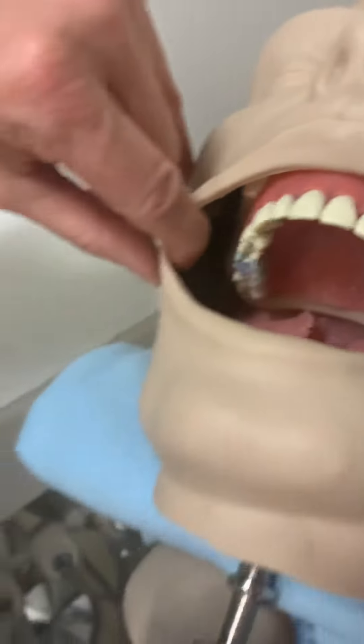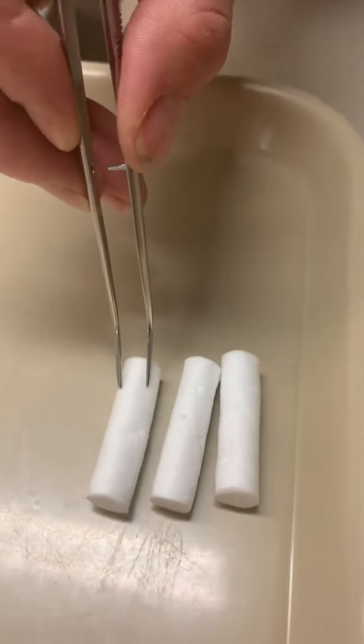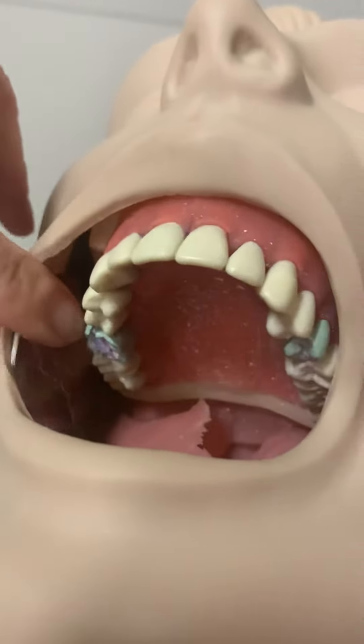The other thing we want to do is put in a cotton roll — and we're not going to stab the cotton roll this way. We're going to just pick it up so that it can easily go into the patient's mouth, just like that.